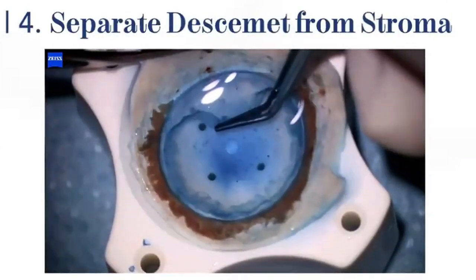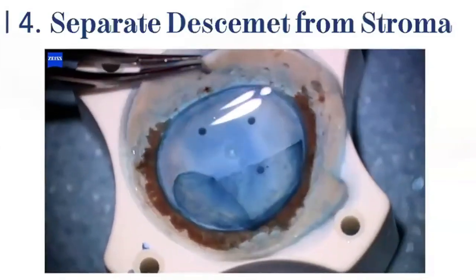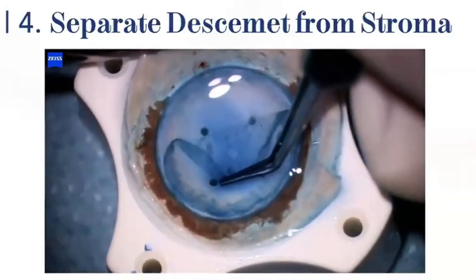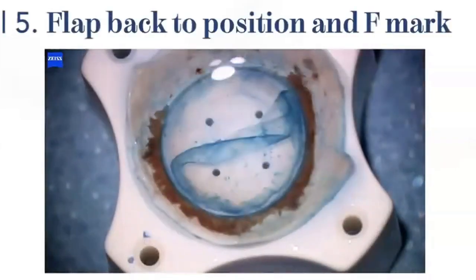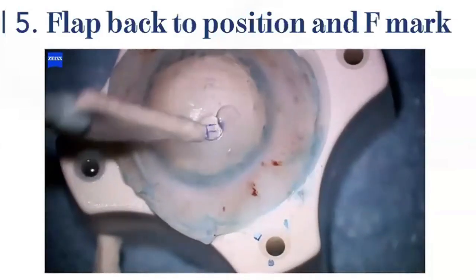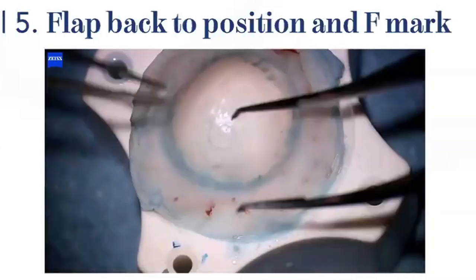Afterwards, I will use the Kelman-McPherson forceps to grasp my Descemet until halfway. I will use the biopsy punch to create a small stromal punch. Here, I'm using the 2 millimeters punch. Then the flap is laying back. I go epithelial side, and then we will mark our graft for orientation. I use the F and a dot, but people also can use an S.